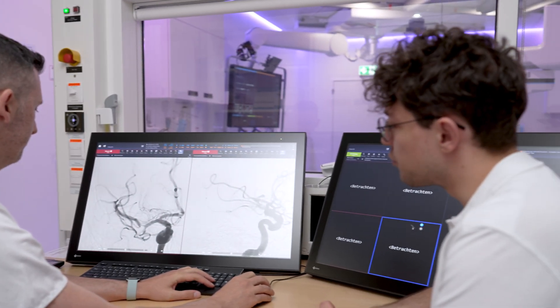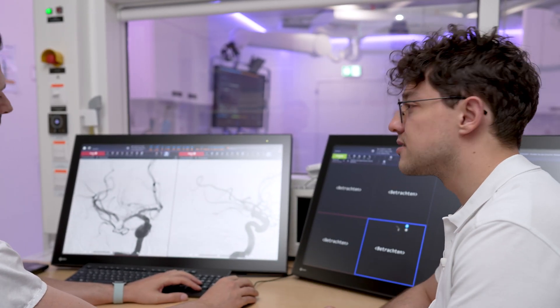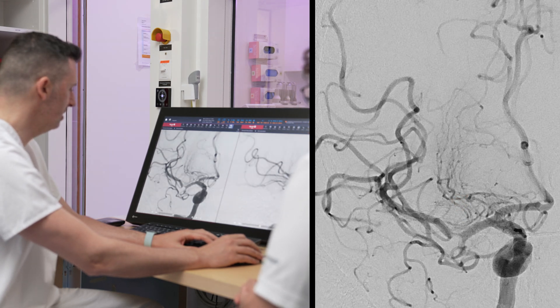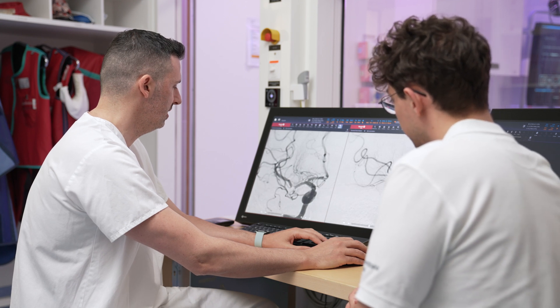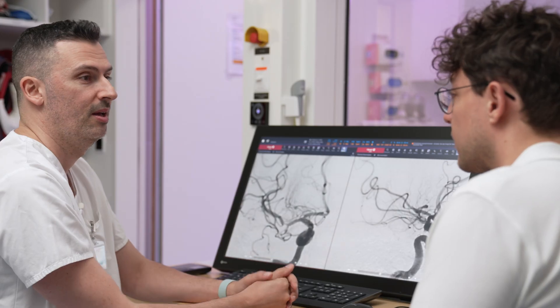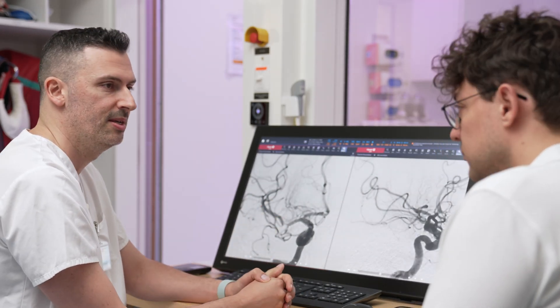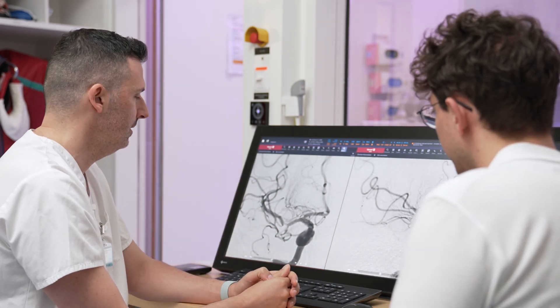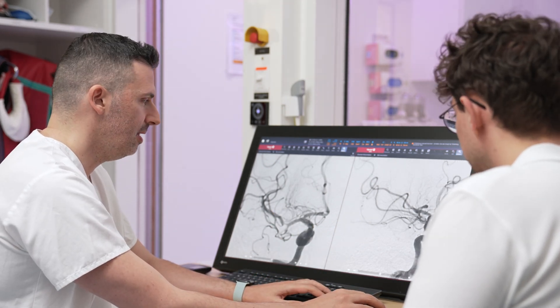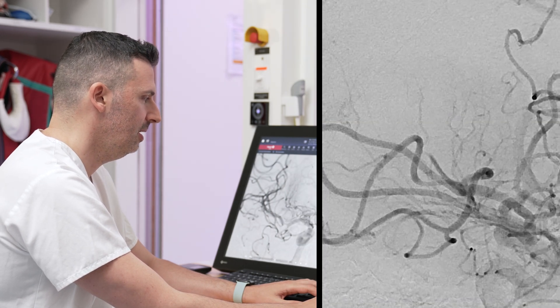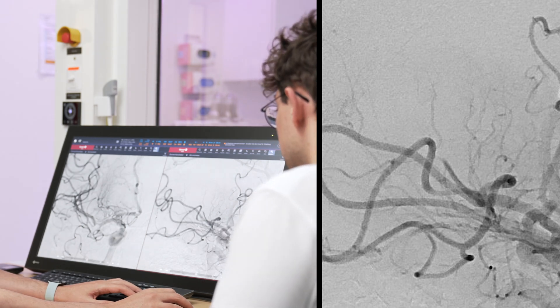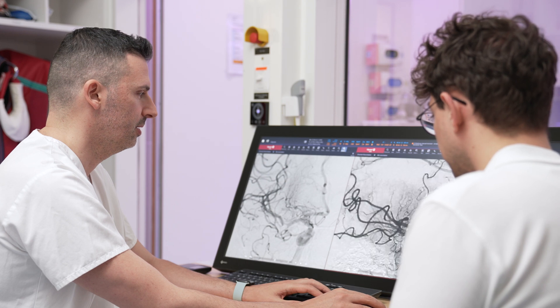Could you just do one overview of which vessel is which so we can be a bit more oriented? So this is the M1 and then you have here the bifurcation — it's a bit of an early bifurcation. What you actually see here is a stenosis of the M2. You have the superior trunk, the inferior trunk, and this is probably a residual stenosis. Now the interesting question is: is it an atheroma? What we do in those cases is we sometimes wait a couple of minutes and see what happens with this stenosis, because in some cases it's just a residual clot and with TPA it can also resolve. The other interesting thing if you check this lateral angiogram is that you see there is a distal occlusion — a distal M2 occlusion.